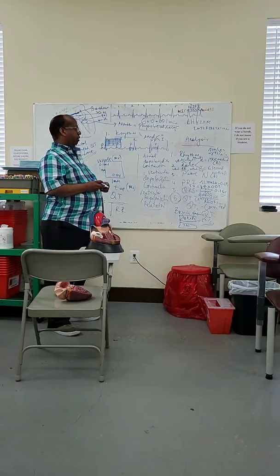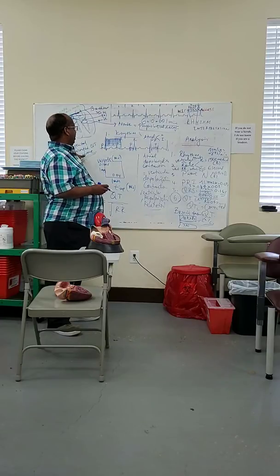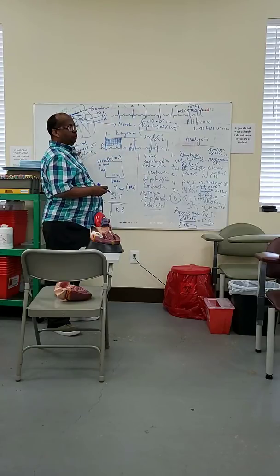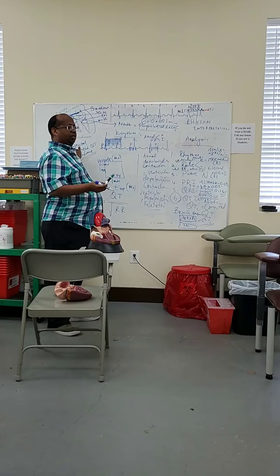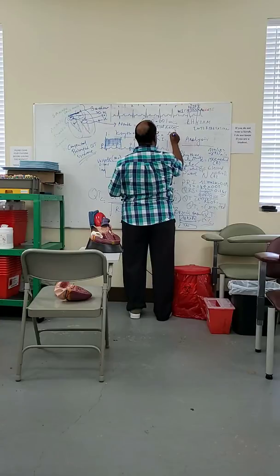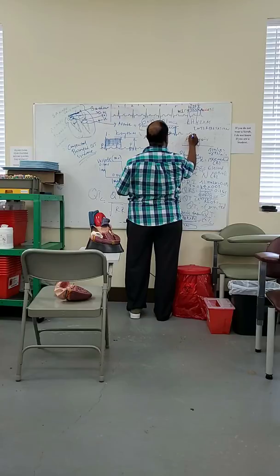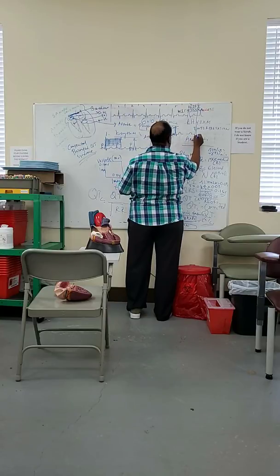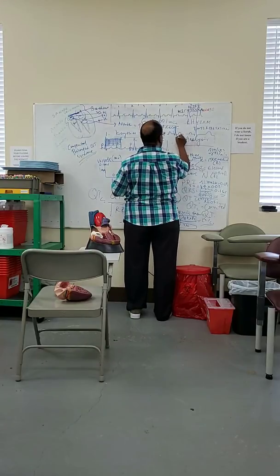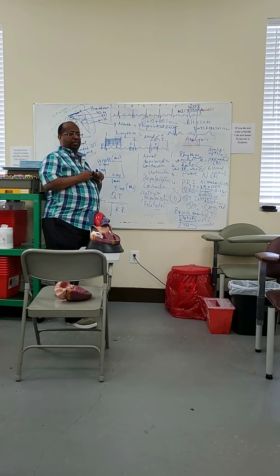So Doctor, one more time, why is QT very important for us? If there is any prolongation of the QT interval, especially in babies and children, there is what we call congenital prolonged QT syndrome. From birth, they have a prolonged QT. Let's say the normal QT is like this, but the abnormal, prolonged QT will be like this. Can you see? Here, QT is normal, and this one is prolonged. It's called prolonged QT syndrome.